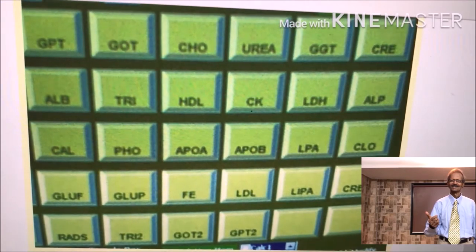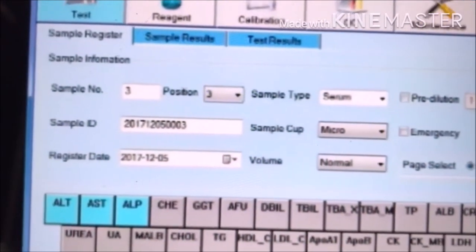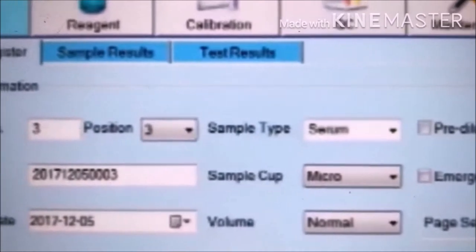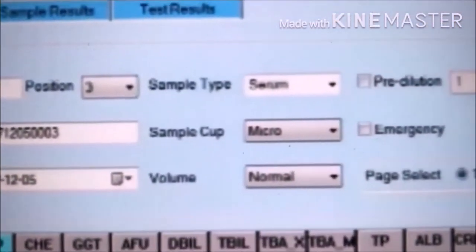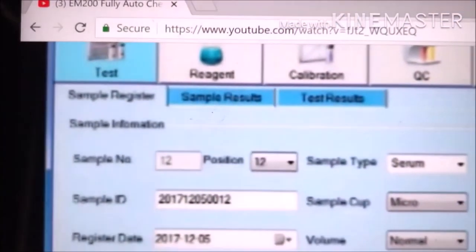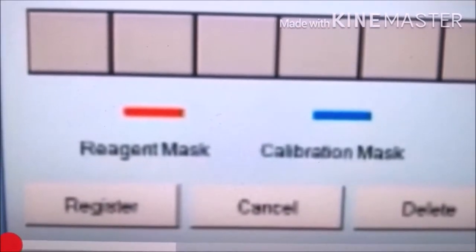This is how patient data is entered: patient number 3, test ALT, AST and ALT, sample number, position number, sample type and then sample ID and date. Select all this information. For emergency samples, use this emergency mode and then sample number and position number. Select test for the emergency sample. Register the emergency sample and also register the batch mode.